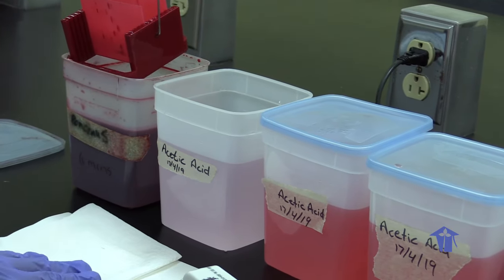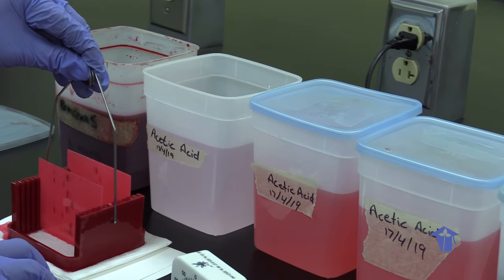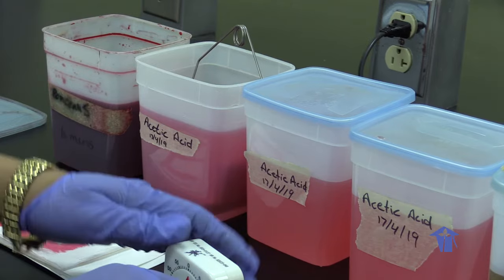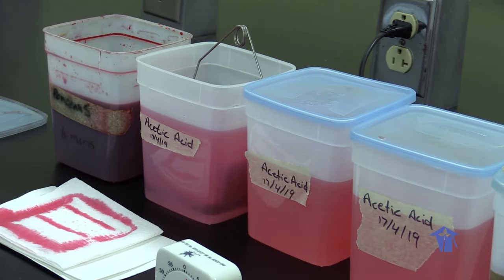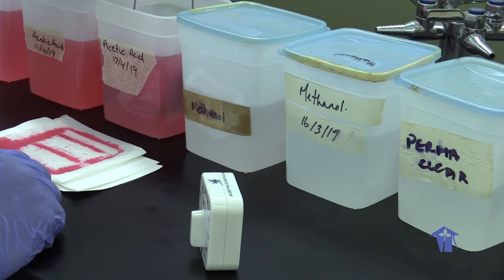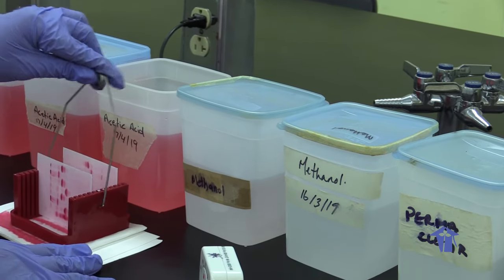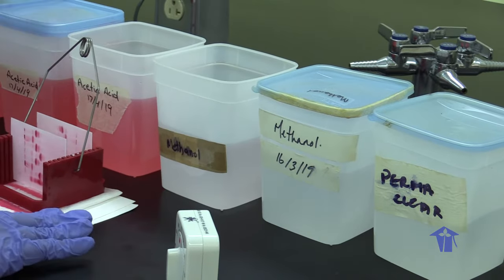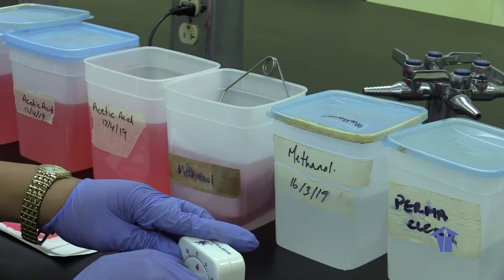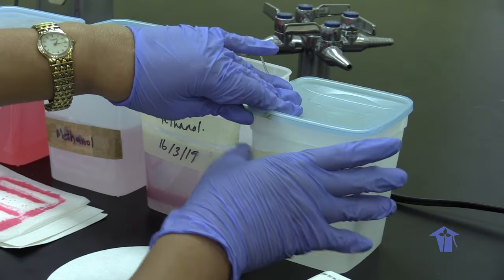3 stations of that, 2 minutes each, and that part of the staining procedure is to de-stain. So after the 3rd acetic acid, place it in methanol to dehydrate the slide. 2 minutes again. 2 methanol. So after the second methanol, we're going to put it in Permaclear for 3 minutes.